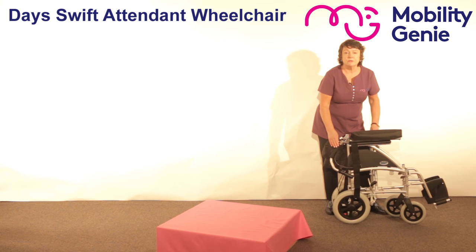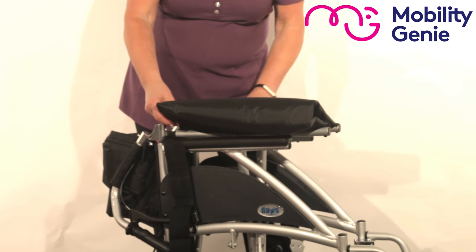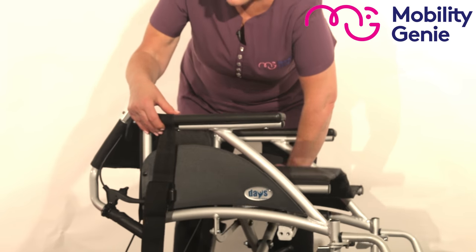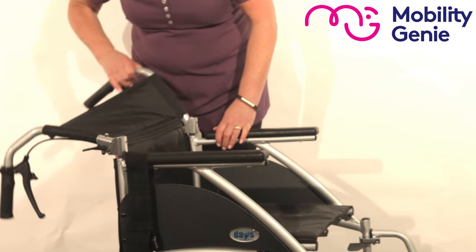When you're taking a wheelchair apart, you've got a bar on either side of the seat of the wheelchair, and if you tilt the chair ever so slightly and give it a push, it takes a lot of the pressure off your back when you're managing a wheelchair.